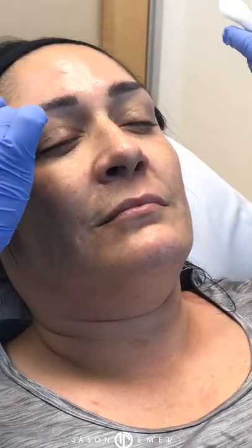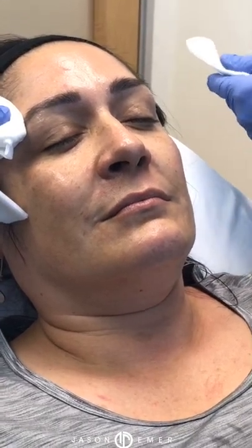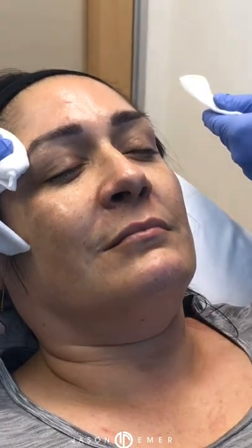Oh, someone took my needle top here. So here it is. 1 second. You might have a little pain when you chew tomorrow because the muscle of chewing is in the temple. And so we're working through that muscle. But it's not going to harm you in any way. This is a very safe area to inject fillers, even though it makes people a little more nervous. Hold on. A little clog. 1 sec, guys.